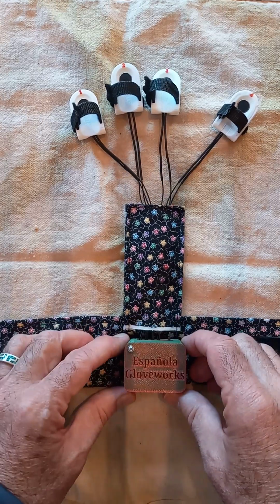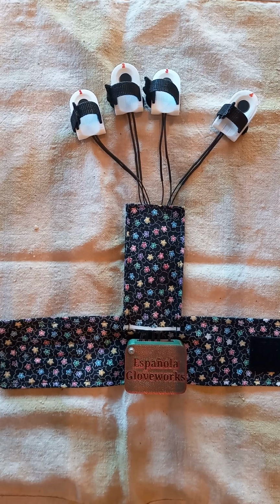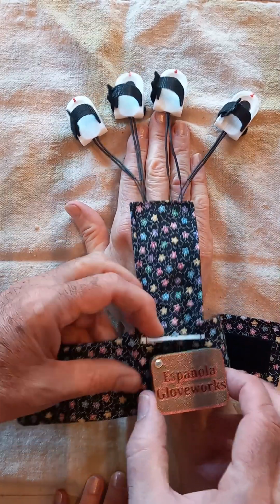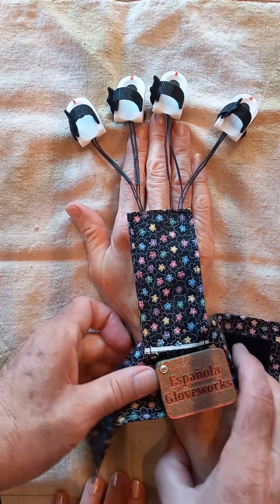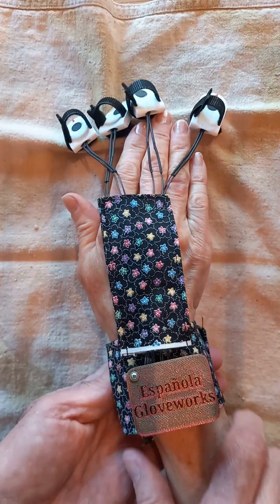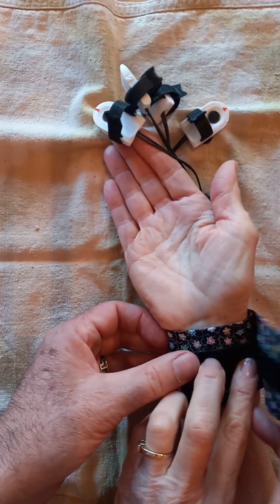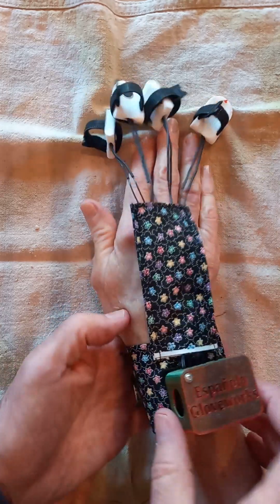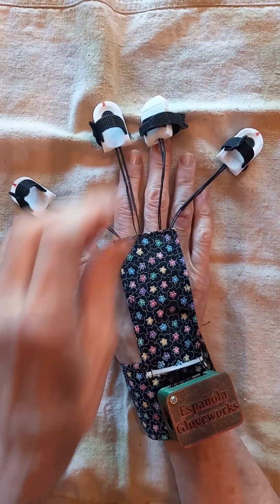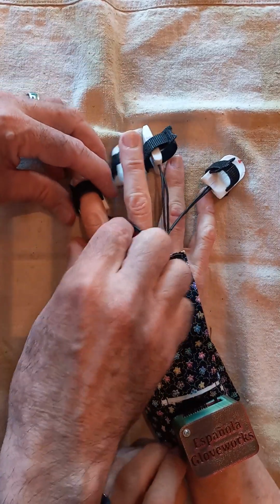Let's see how to put it on, right? So I have a lovely assistant who's gonna join us. And we're gonna first put it around her wrist, right? And so the box goes on top. There's a couple pieces of Velcro down below. Fantastic. So maybe she can just turn her hand over a little bit and we can see how the Velcro goes on and off, and try to get a comfortable but snug fit. Okay. And then once that's there, she's going to lay out the fingers, and we can help her.